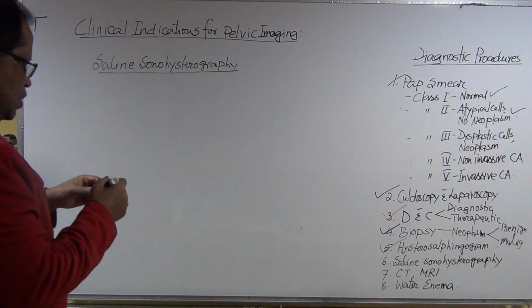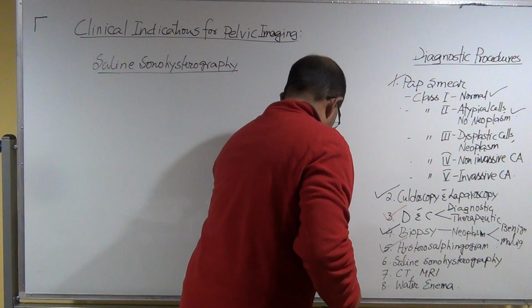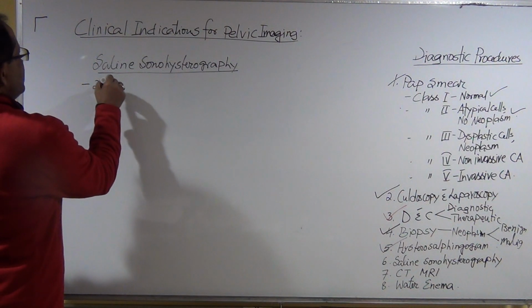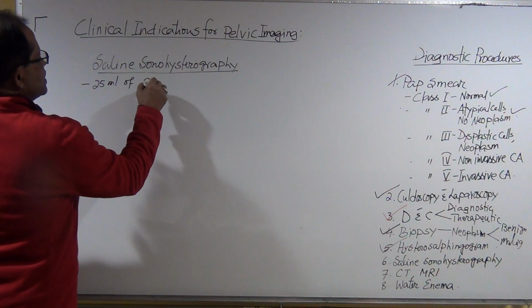Saline sonohysterography. That means they use saline water, 25 ml of saline water.